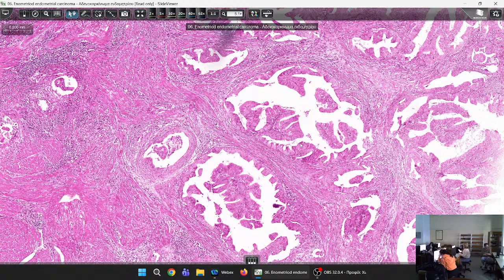of the endometrium on sites of adenomyosis? The cells are atypical. They are just like cancer cells. But if it were atypical hyperplasia in a focus of adenomyosis, then what would be around these atypical structures? Normal stroma, which is not the case here. Remember how the normal stroma of the endometrium looks like?